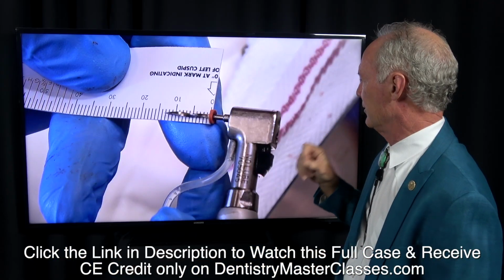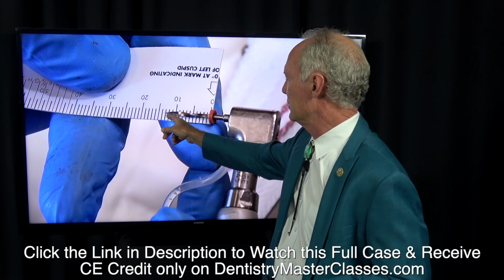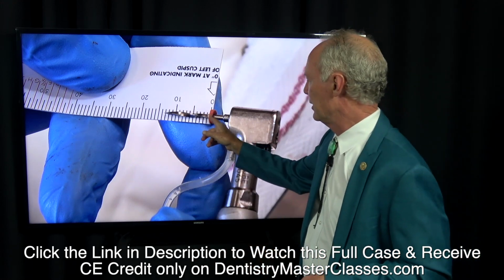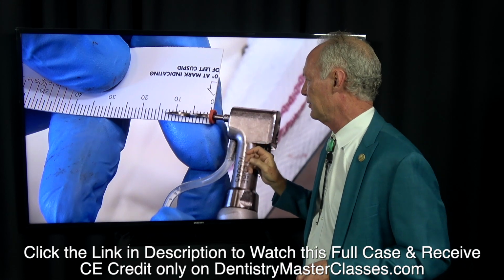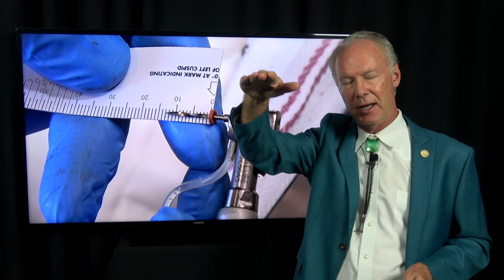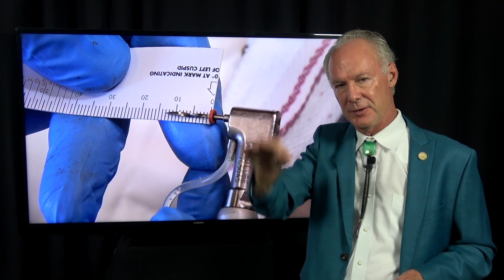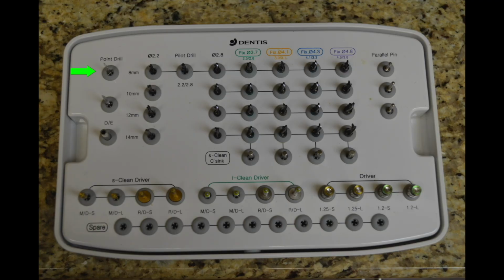Now we'll go back to this. So I'm measuring safely. You know, this tip is about 13. This measurement of the endo stop to the tip of the pilot drill is from the crest of the gingiva, not the bone. So you've got to add 2 millimeters to that measured height. So I've got a good solid 14 millimeters.